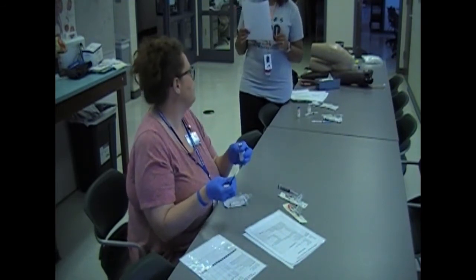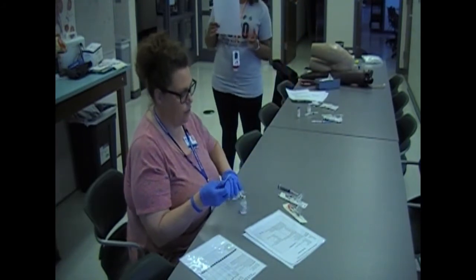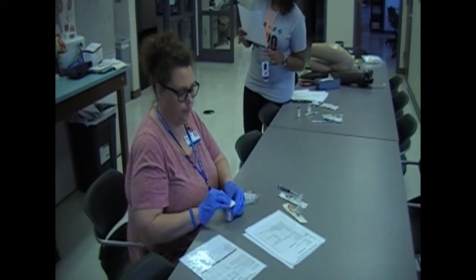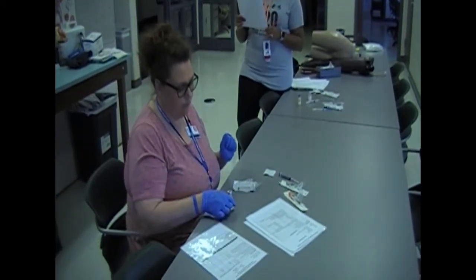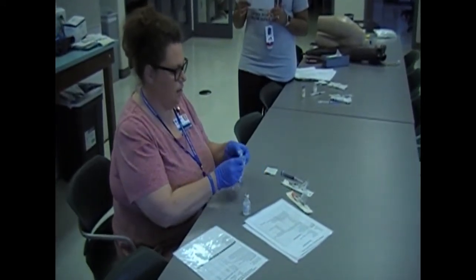Where are we at? You're on second med check. You've got your correct needle and syringe. So you've got your medicine. You need to clean the top of your vial with alcohol and then allow it to dry before inserting the needle into the vial. You may verbalize that you have allowed it to dry. So I've allowed that to dry.